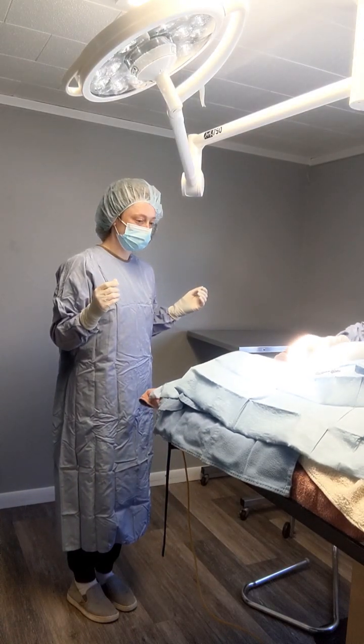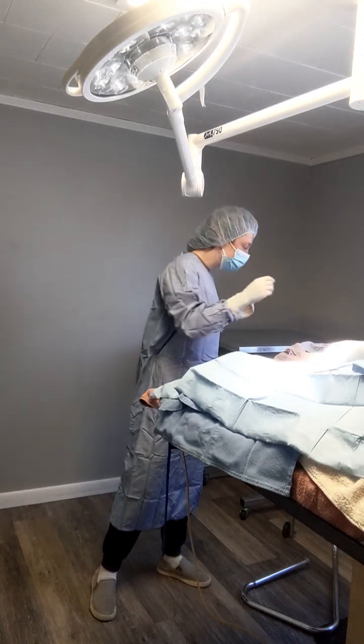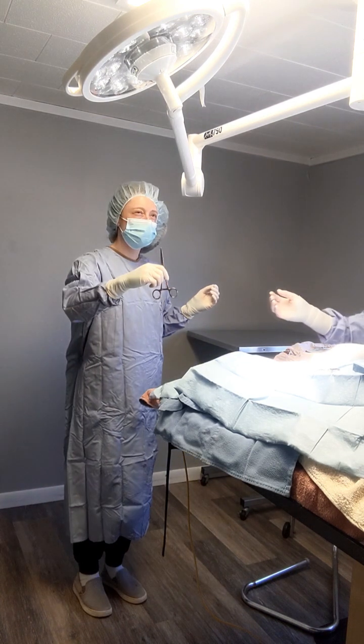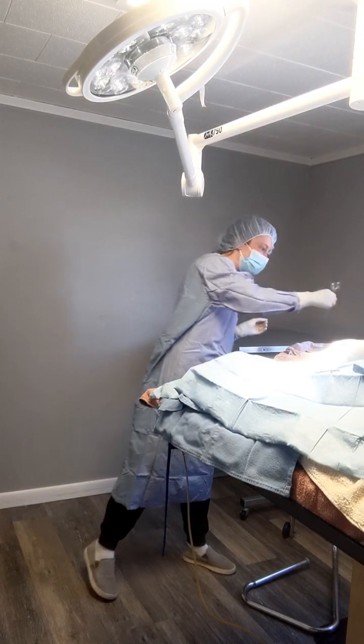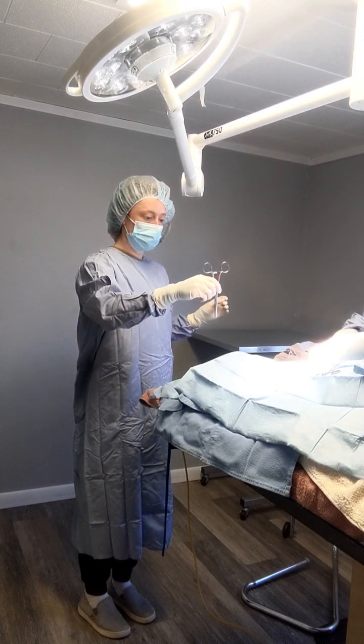Okay, I like it. So we'll clamp this side. You can hand me the hemostat. Clamp. That's perfect. Okay. I'll do 2 of those. Tip down. So I'm handing the hemostats. I want to hand the tip down and make sure it's clamped on the first clamp for her.